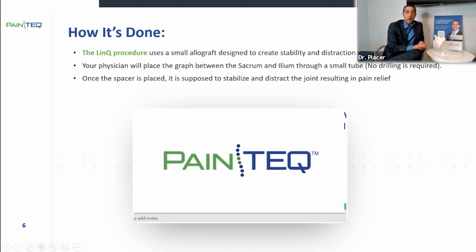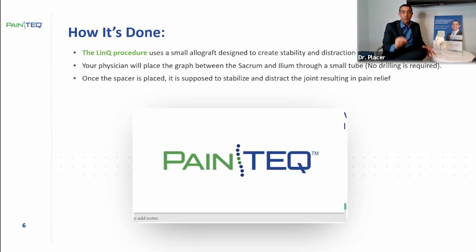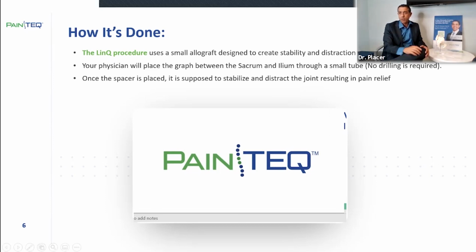There you go. Good video. As you can see, very minimally invasive, less than an inch of incision. One thing is we don't have to go and screw anything. We just go from the inside and we create stability by putting that device inside the joint. So the minimally invasive small incision, and if we go to the next slide, we can talk about the recovery.